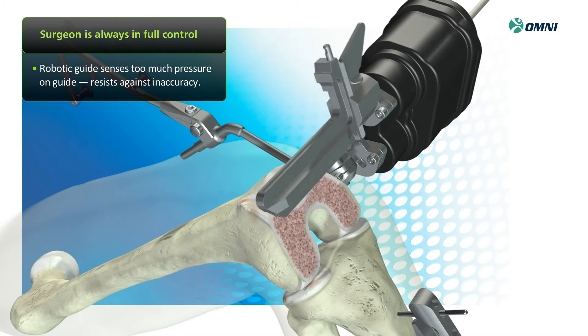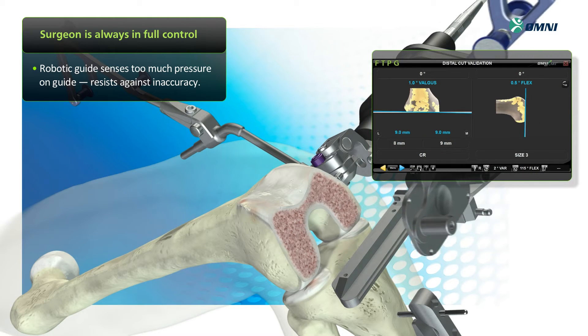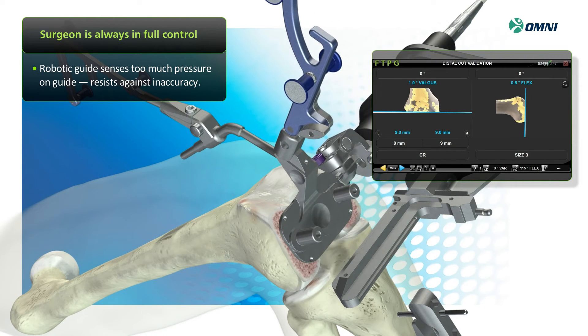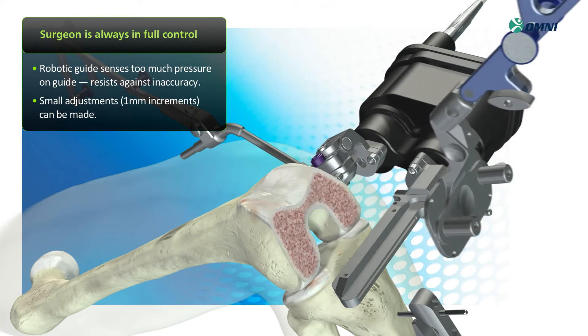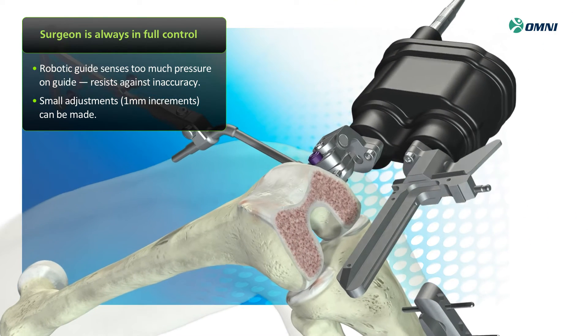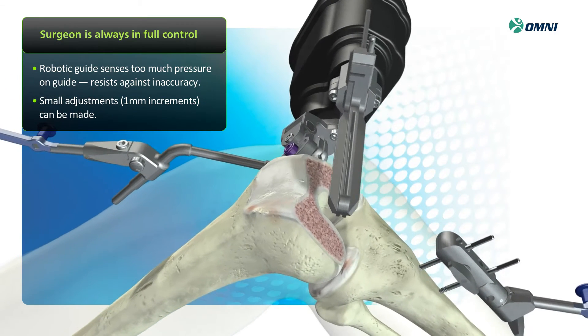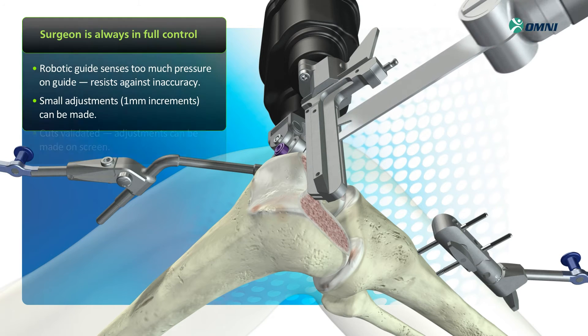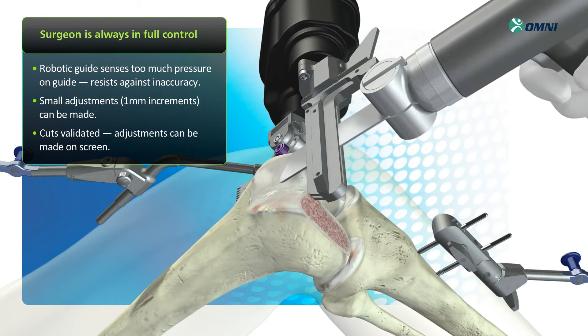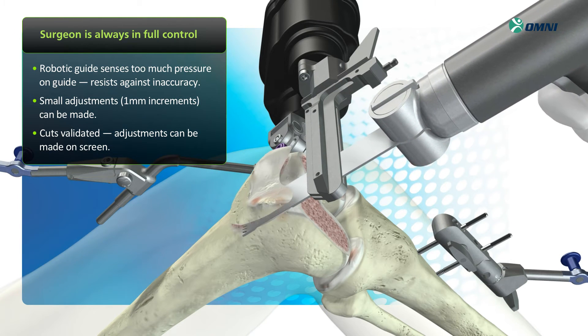After each resection has been completed, cuts are validated using the G-pointer. If necessary, small adjustments — as little as one millimeter in thickness — can be made. After confirming the distal cut, the cutting guide automatically advances to the next cutting position. The following resections are carried out with equal precision, and every cut can be validated to ensure accuracy.